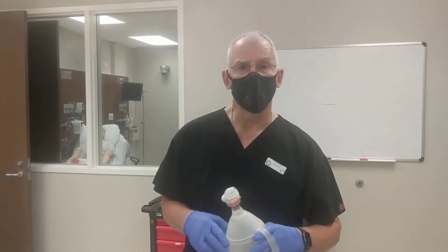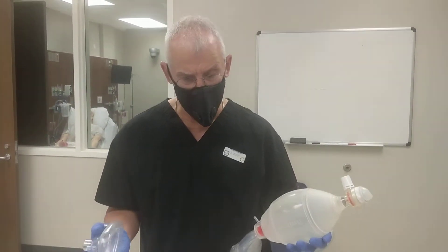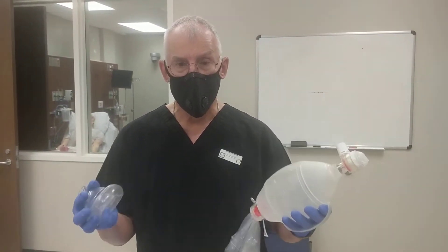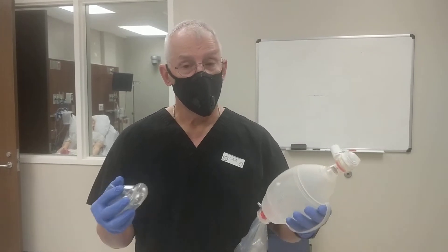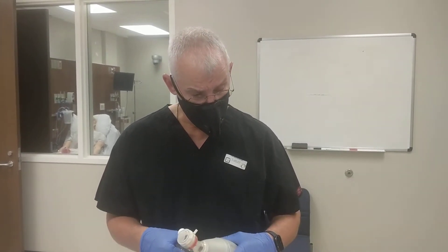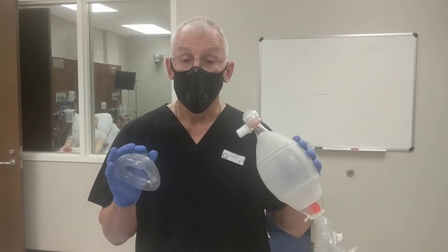Hi, I'm Ken Currington. I'm one of the surgical educators here at CAMELS, and today I'm going to demonstrate proper bag valve mask technique. This is important — you may be called upon to do this maneuver during a code or during a resuscitation, so there are specific aspects of it that will allow you to perform it well.